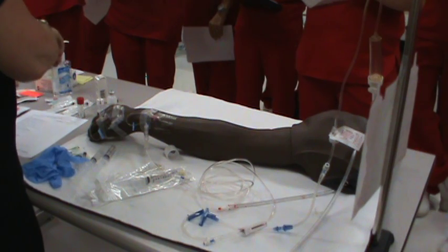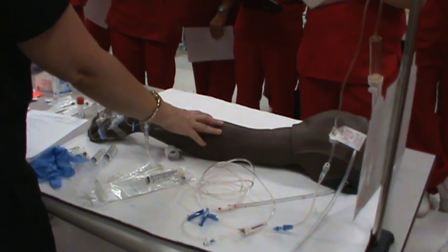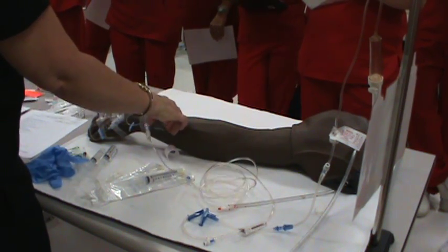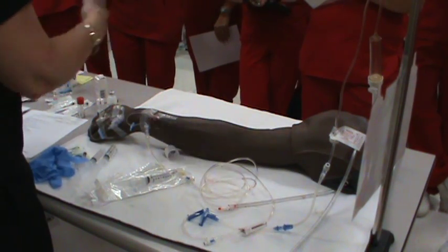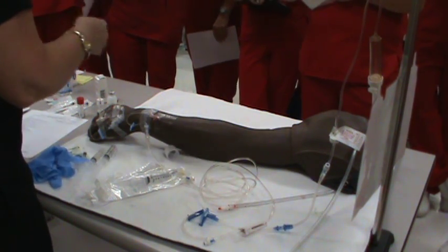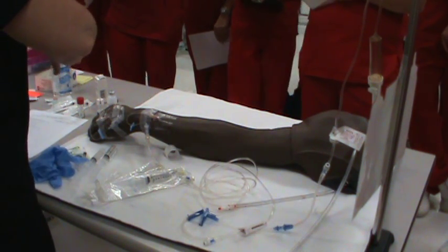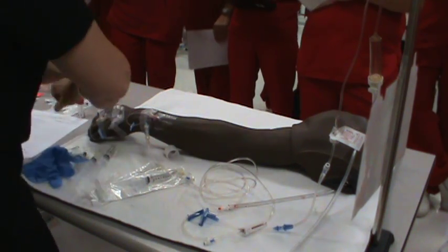And then push it again, wait a minute, because the whole thing is, you're watching your patient for a reaction. You do have a little bit of dead space in there, but it's not going to be enough to not see a reaction. But yeah, I think it's the easiest. If you slowly push your med, I'm not that good at sitting there and watching while pushing, so that makes sense.